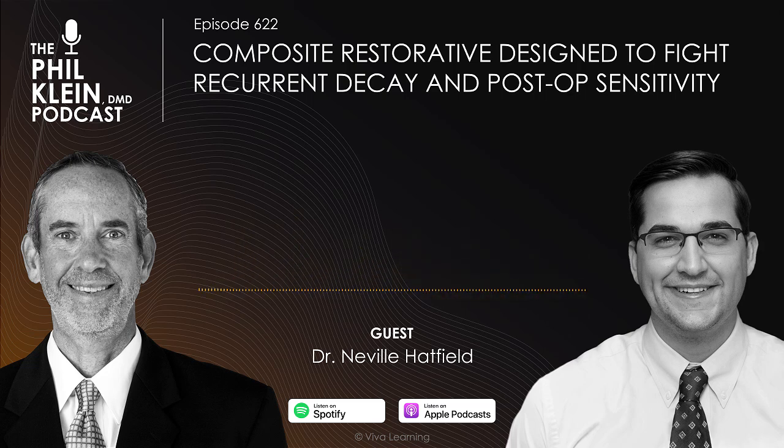Is that a single bottle technique? Yeah, so single bottle is probably the most common nowadays, but there are still people out there, especially in the biomimetic dentistry space, that really say and live by the two bottle bonding system. So it's really important to understand exactly what the primer and bonding agent and everything like that is in your component of your bonding agent. But in my day-to-day dentistry, I would use a seventh generation bonding agent.